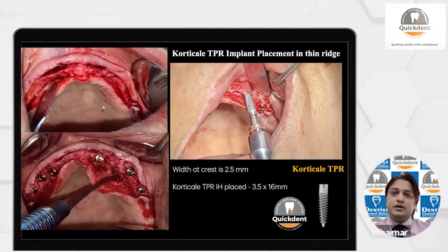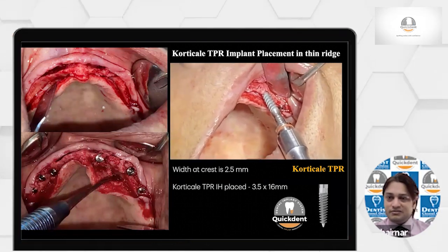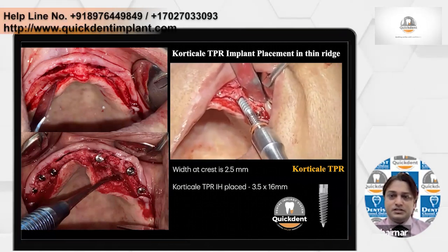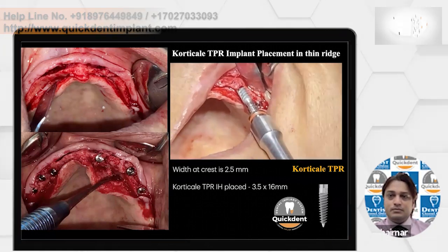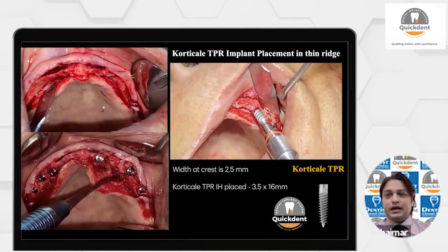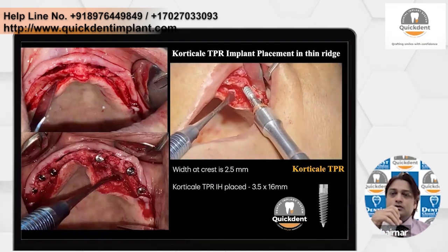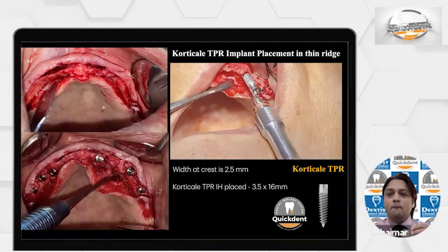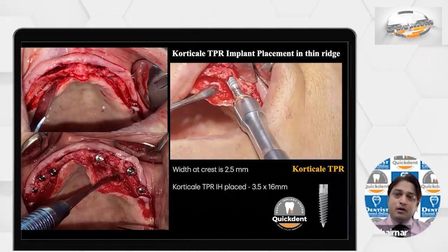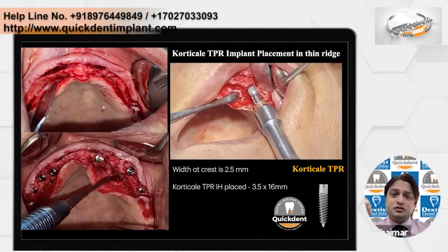One of my periosteal elevators is holding the bone so that the bone doesn't fracture, and I'm placing it very softly. You can see I'm slowly placing it, not exerting any extra force on the buccal bone. Our direction of insertion should be similar to the direction of osteotomy.